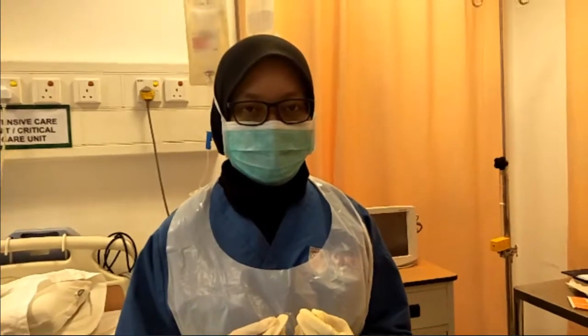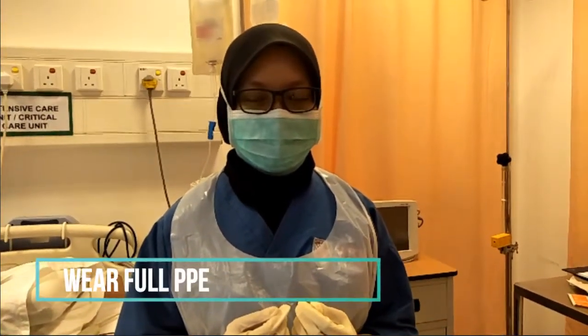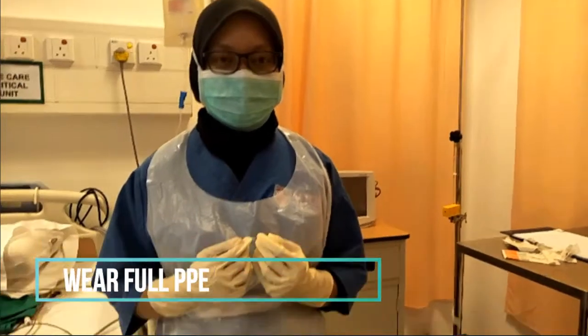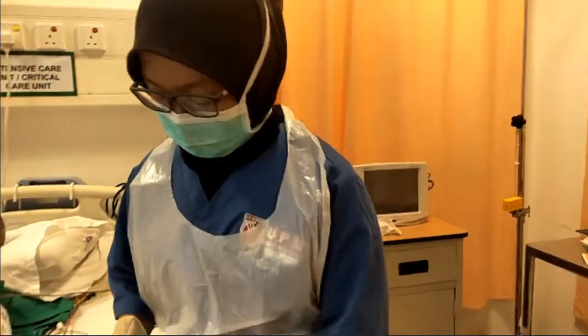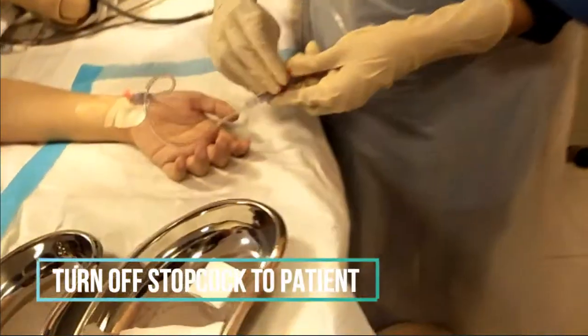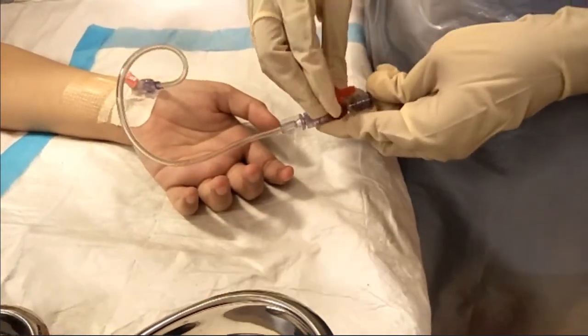The first step to remove the arterial line is to ensure the nurse wears full PPE. Turn off the stopcock to the patient. Remove the adhesive dressing.